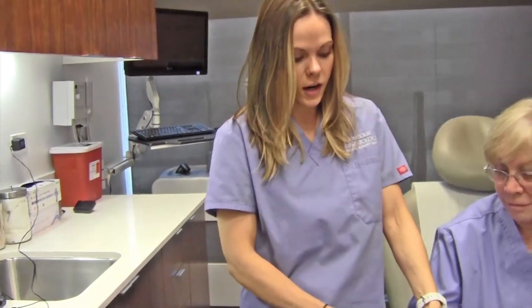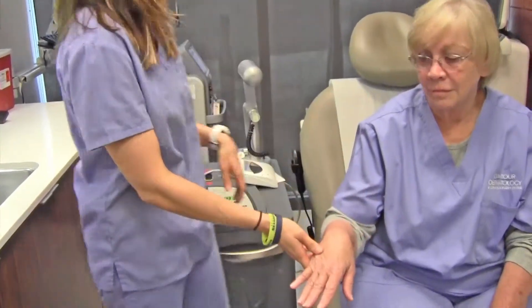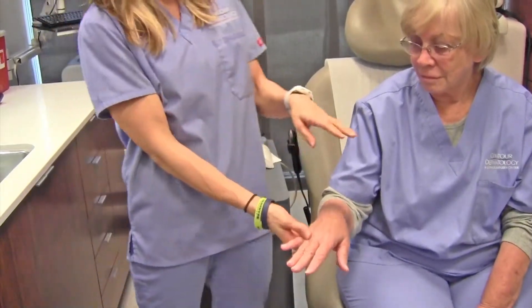Sunspots typically occur on the hands, face, arms, anywhere that you've gotten sun over the years. So today we're going to be doing the hands.